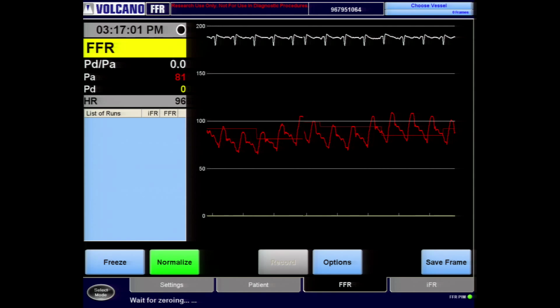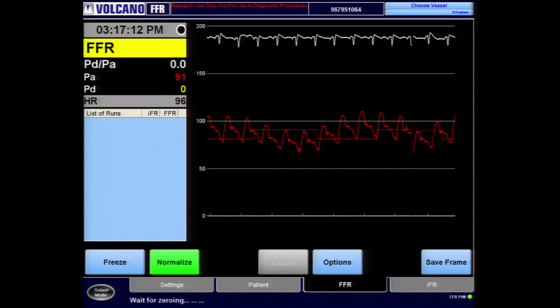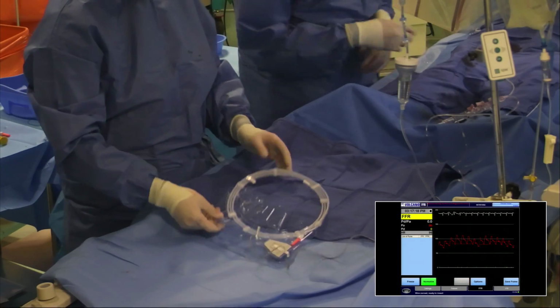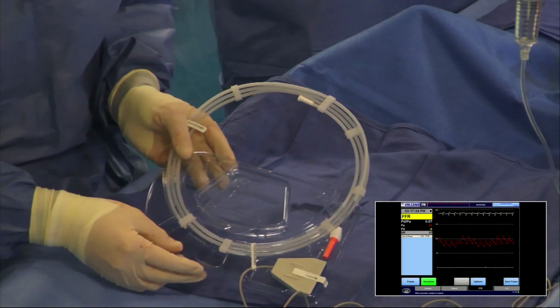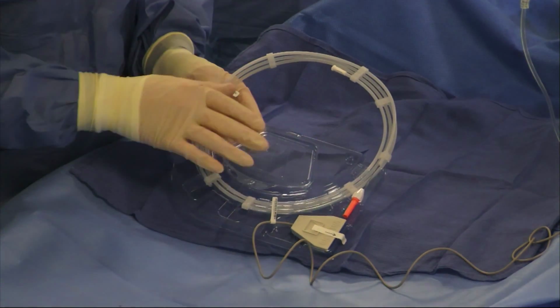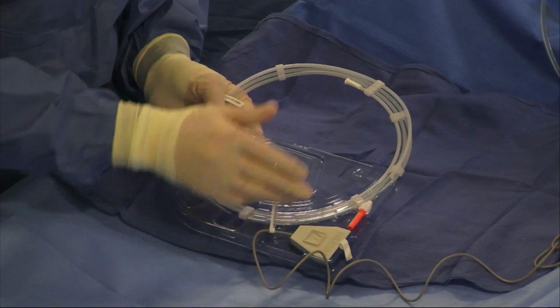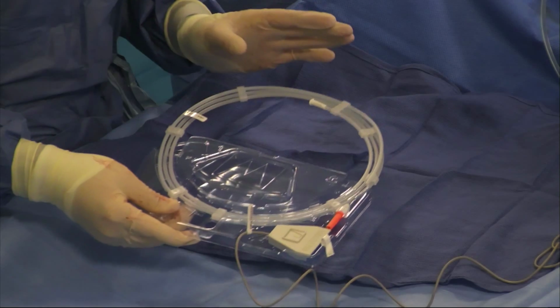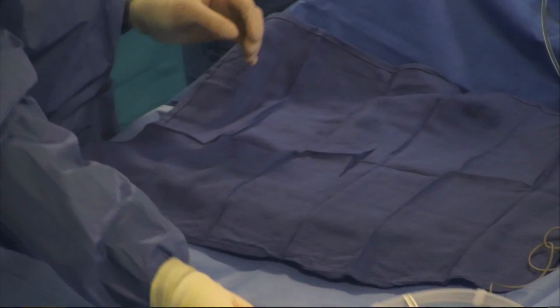Once that's in, this is an important bit, because this is essentially now saying that the console knows where 0 is as a kind of standard. So this basically now tells us, let's just focus in on the wire itself, and the physiology can come off the screen. You can see that we've essentially got a wire which is ready to go, and the last thing we want to do is unpack this from the wire, and begin the next phase, which is to reshape the end of the wire so it's appropriate for physiology.